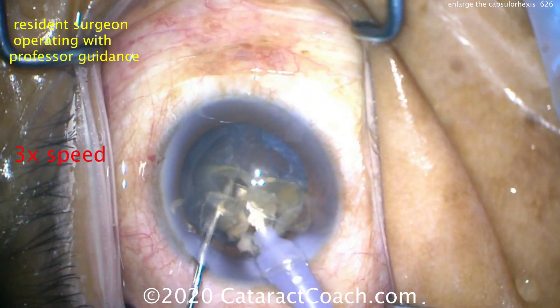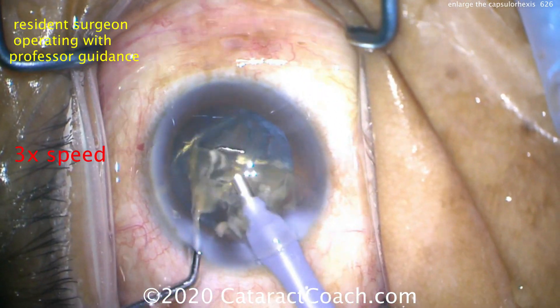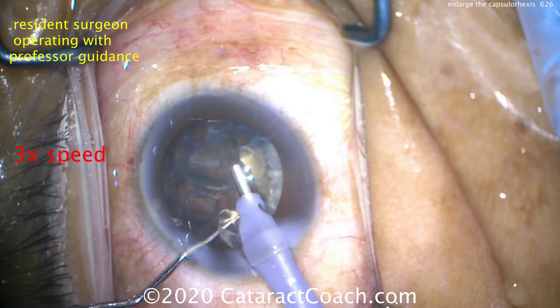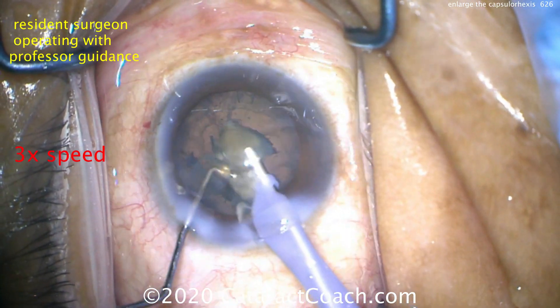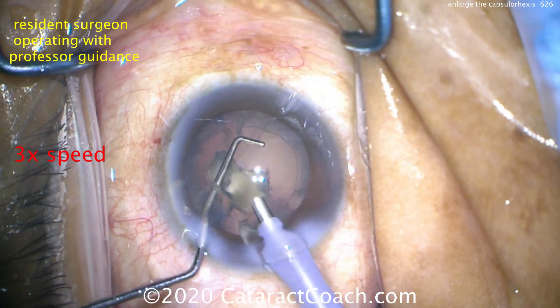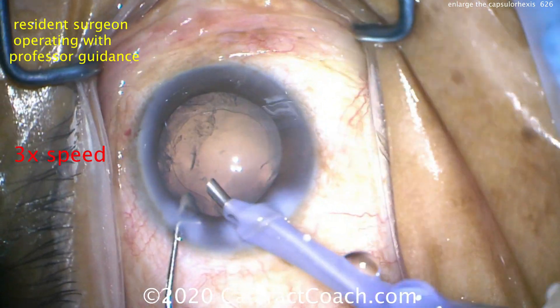Also, there's less risk of inadvertently hitting the anterior capsular rim with our instruments — with the phaco probe or the chopper. So definitely we want a 5mm capsorhexis, or even 5.5mm in a very dense cataract. In fact, if it's a super dense cataract, I don't mind if you make a 6mm capsorhexis — 6.5 — even if it doesn't overlap the optic. Because to remove the cataract, it's going to be a lot safer.